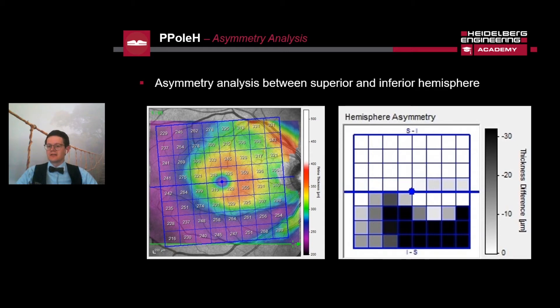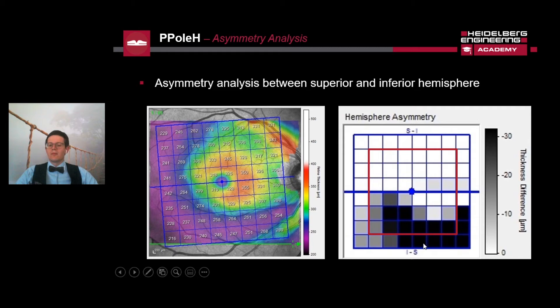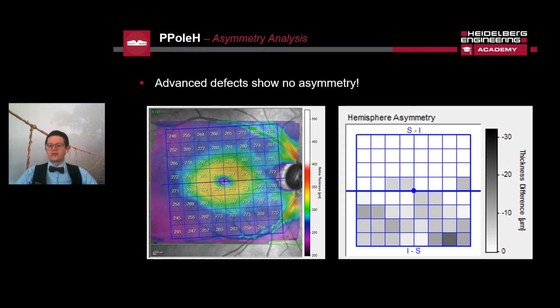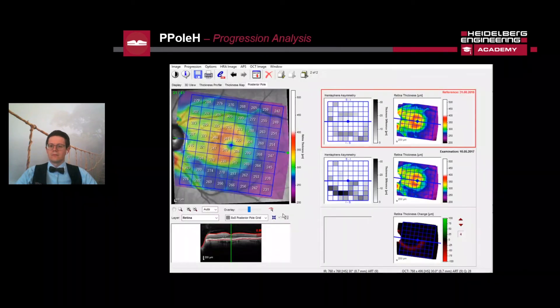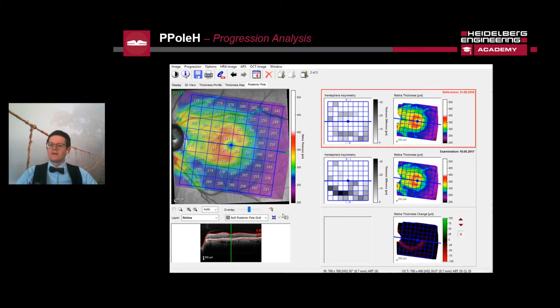The full retinal thickness asymmetry analysis quantifies imbalances between the inferior and superior macula, as well as between the left and the right eye, serving as an aid in identifying potential glaucomatous damage. Always be aware that the peripheral squares may not give the best information because in those areas we have large and asymmetrical vessels. However, you should never rely solely on the hemisphere asymmetry analysis, because this case perfectly shows that we don't see any asymmetry in an advanced glaucomatous eye.